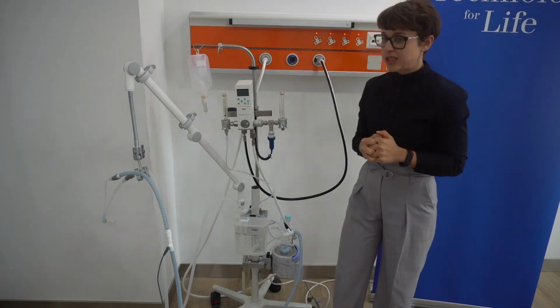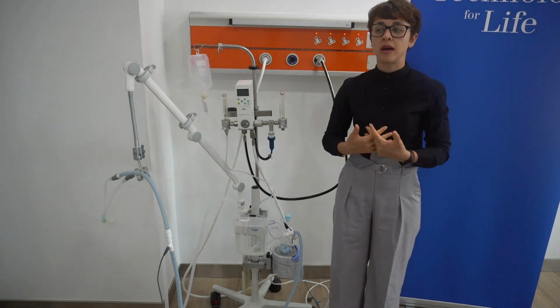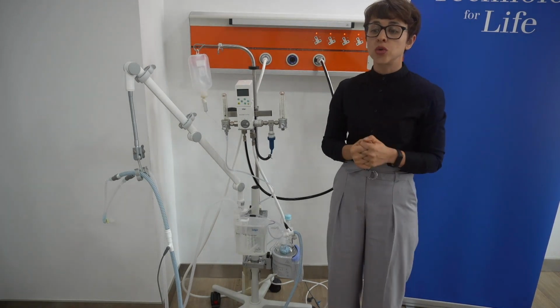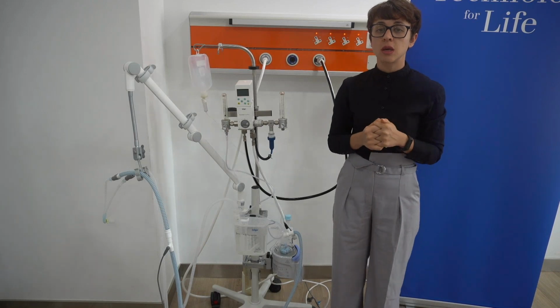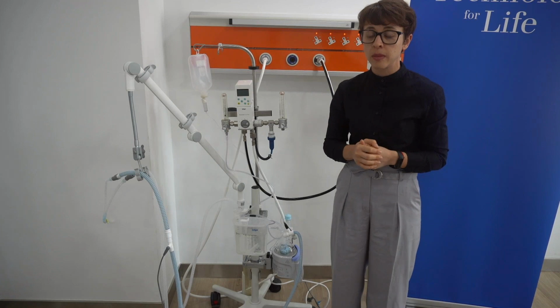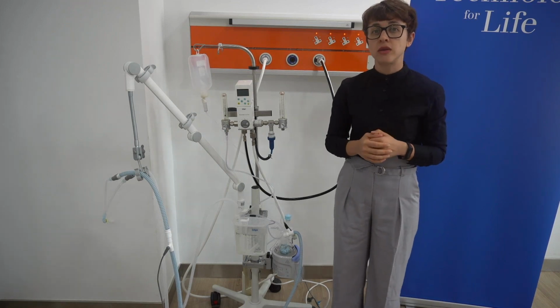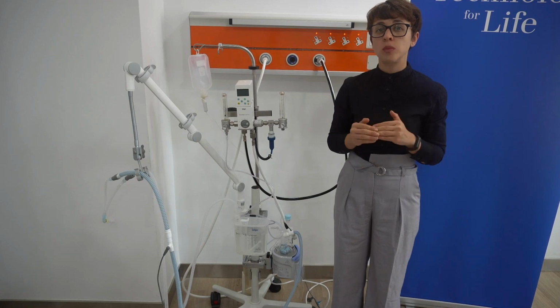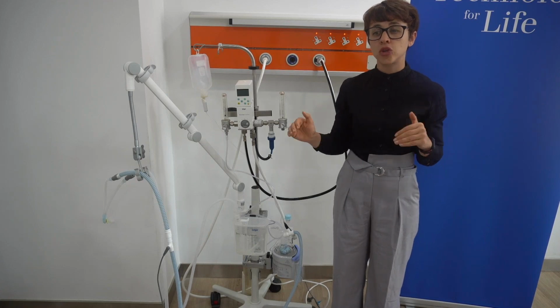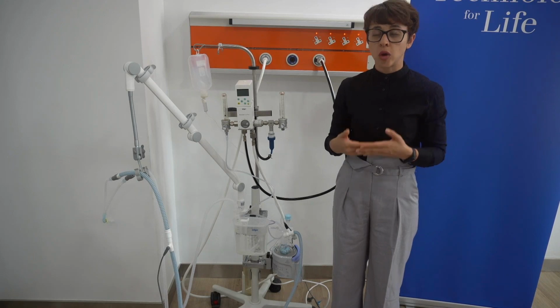Okay, so why do we use the Bubble CPAP? Bubble CPAP is used to generate continuous positive airway pressure. So that is what CPAP stands for. And basically, this is suitable for spontaneously breathing patients to maintain the alveolar pressure, so that at the end of expiration, the alveoli do not collapse.